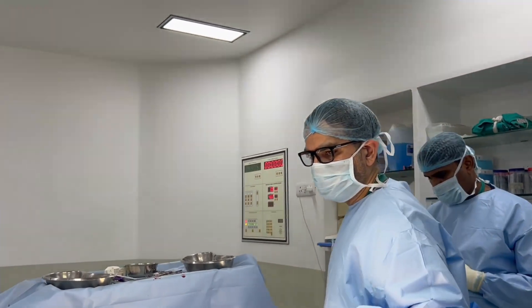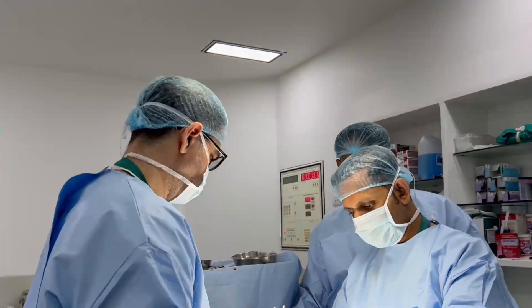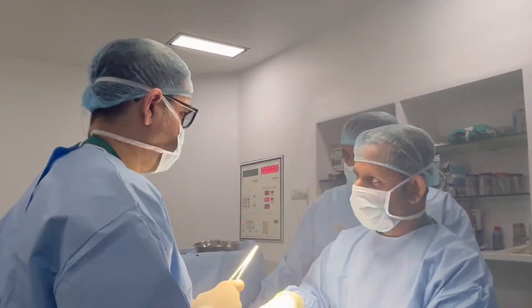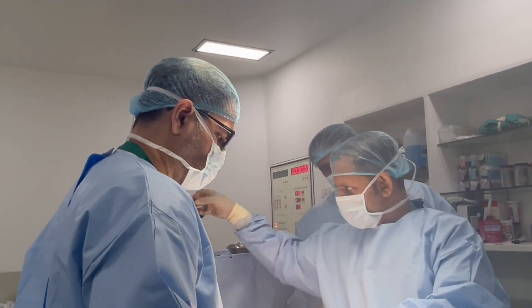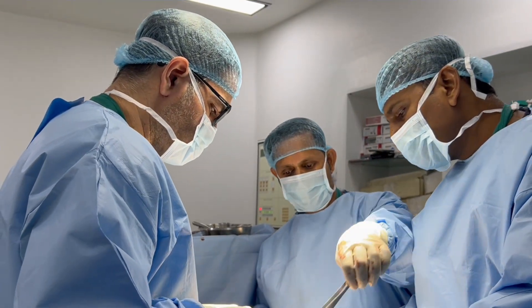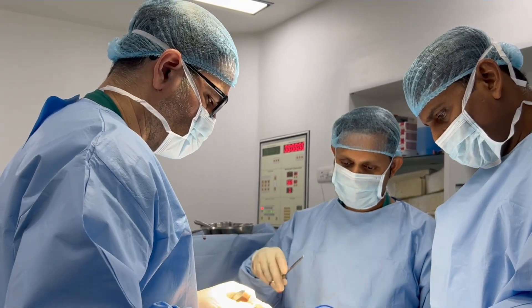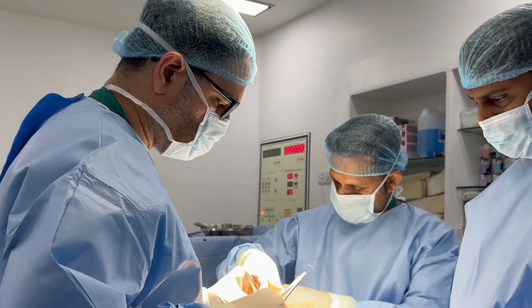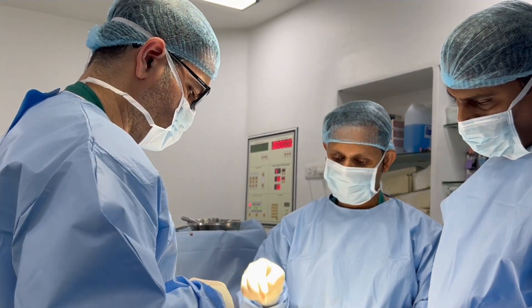Now we will close the corpora. One side is closed and we will close the other side. Now we have to close the corpora and irrigate the wound with antibiotic. After closing the corpora, we will close all the layers and we will close the skin. We close in two or three layers so that the implant has no communication with the skin and there is good sealing so the implant is not going to get infected from outside.